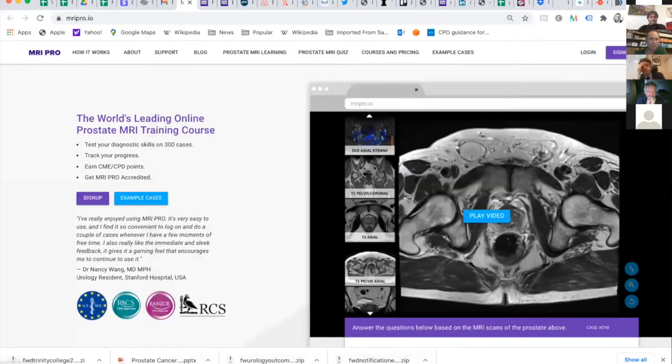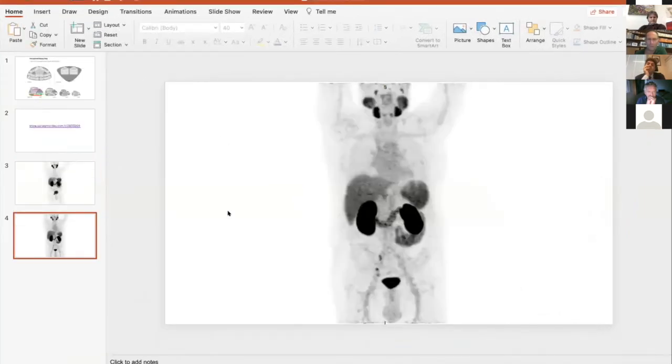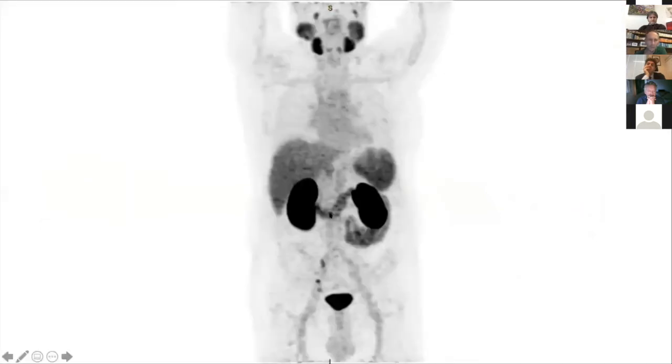So just show you this, get rid of that. So this now was the PSMA PET when his PSA was 0.36. And what you can see here, I hope, just put it on slideshow. Again, you've got a bit of tracer coming down the right ureter here, but there are two quite clearly positively avid right iliac nodes there above the level of the bladder. So they would have been outside the operative field, but they may well correlate, in fact, to that original MRI, potentially, Richard, that you reported on in terms of location. It does look pretty similar.